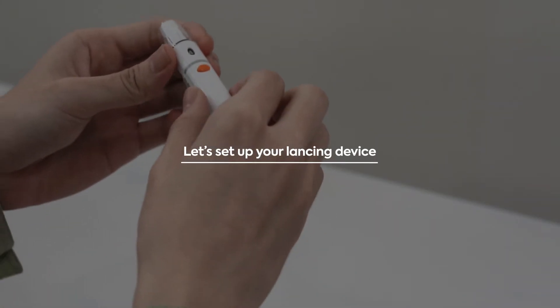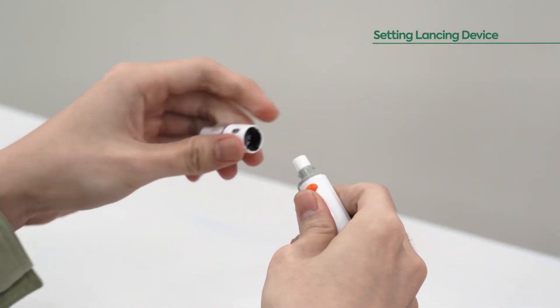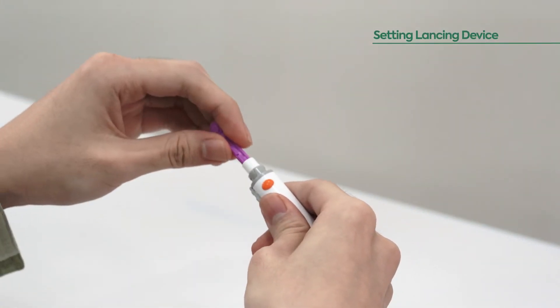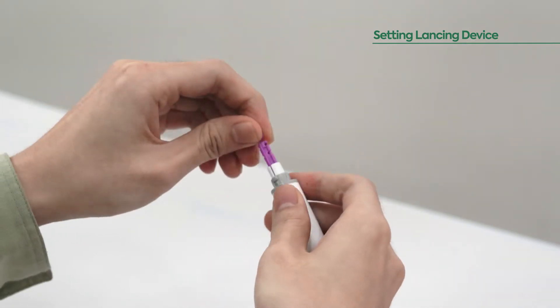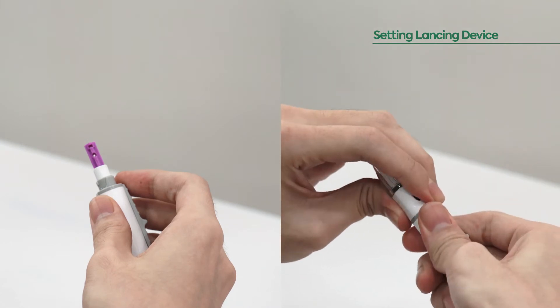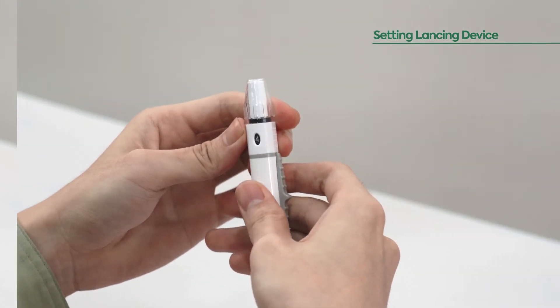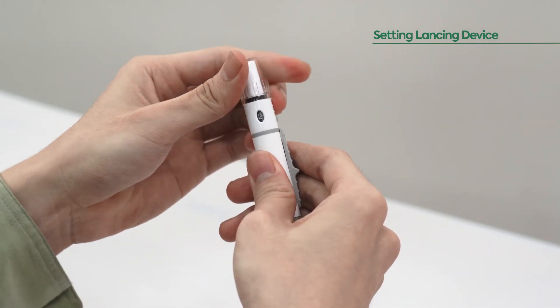Let's set up your lancing device. To use the lancing device, twist off the cap and place a new lancet into the holder cup on the lancing device. Twist off the rounded top and place the device cap back on the lancing device. Next, turn the dial from one to six to the desired depth setting.